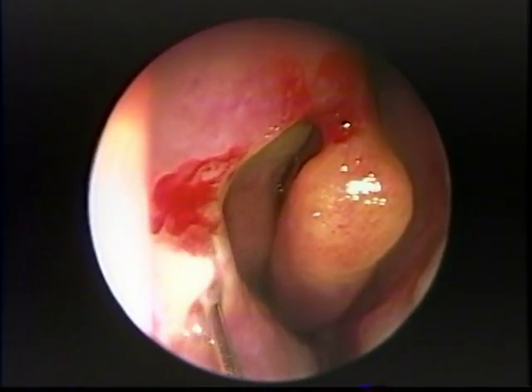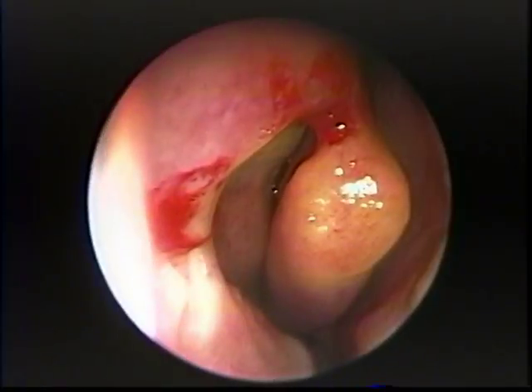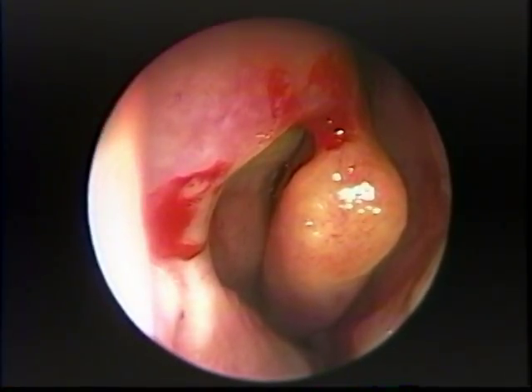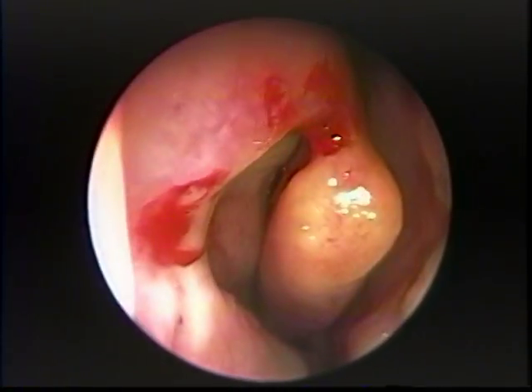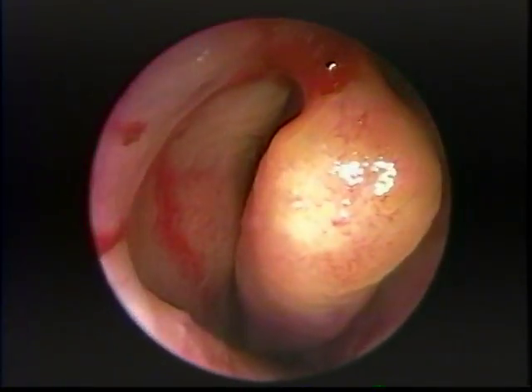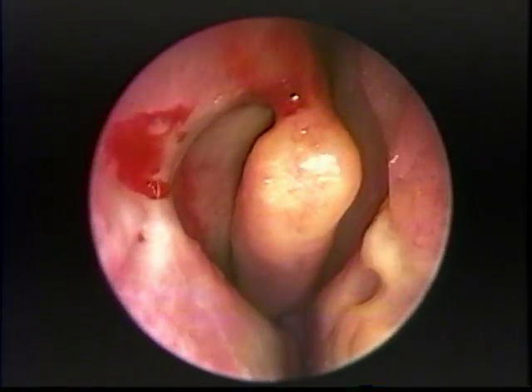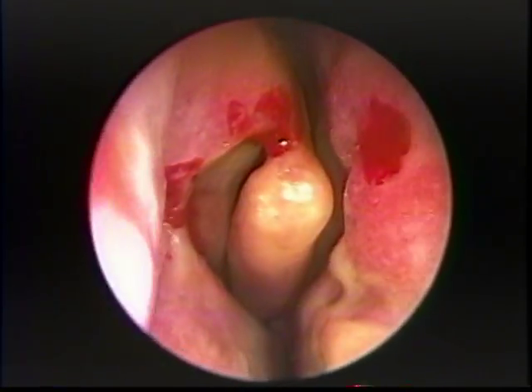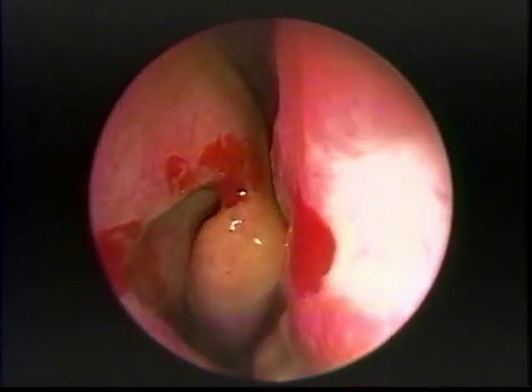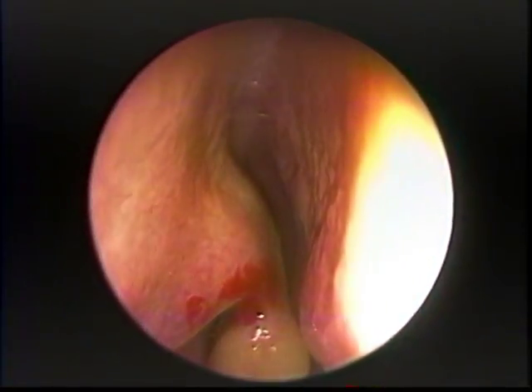CT scan shows localized ostiomeatal complex obstruction together with what may be a type 1 hypoplasia of the maxillary sinus. Unfortunately, the CT scan was done at a rather inappropriate cutting angle and therefore it is very difficult to interpret.